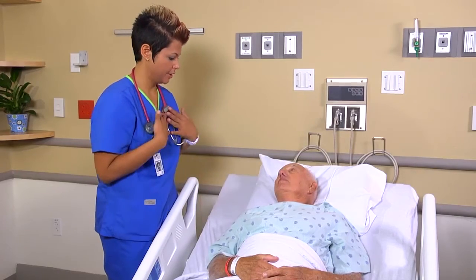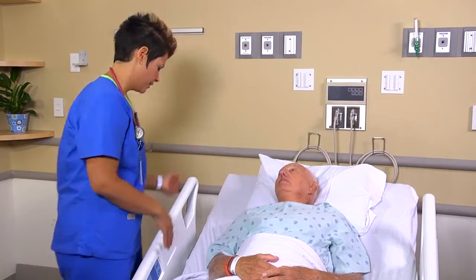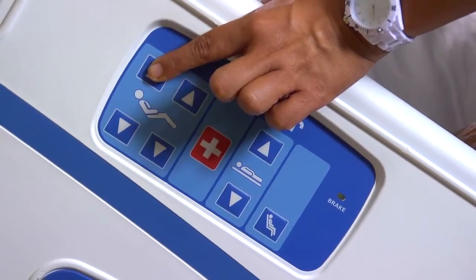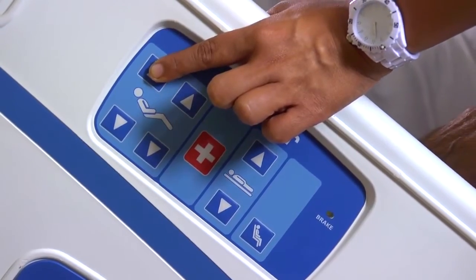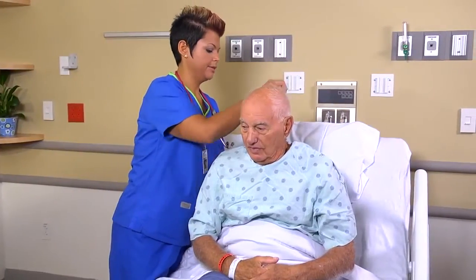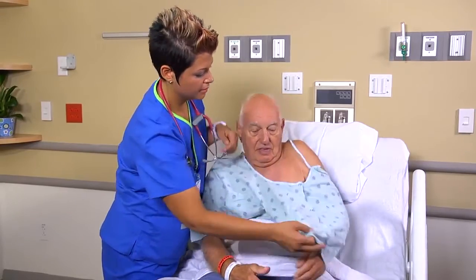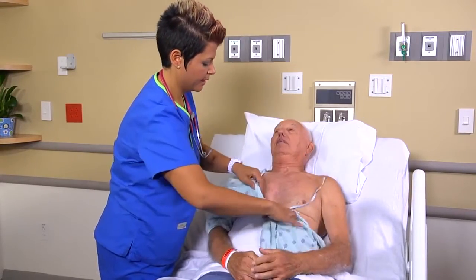We're going to get started. I'm going to take a listen to your heart rate, okay? Clean gloves are worn only when the nurse may be in contact with bodily fluids or the patient is in protective precautions. Help the patient into a supine or sitting position and expose his sternum and the left side of his chest.